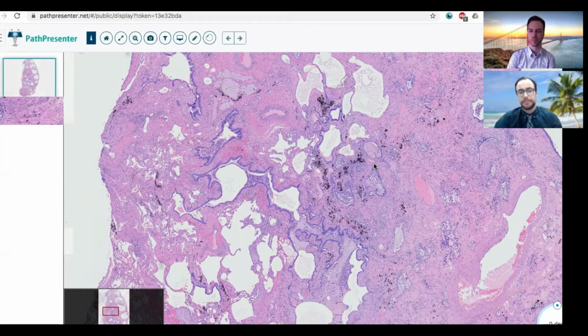Oh, okay, I see. So I think you did a great job with these cases. Did you have any other questions about usual interstitial pneumonia? I guess with random sampling, these must be really difficult to diagnose on a biopsy, for example. If it's a needle biopsy, it's a kind of incidental finding. Yeah, it's a challenging diagnosis. These are typically diagnosed on larger surgical wedge biopsies, which is what this is a case of.